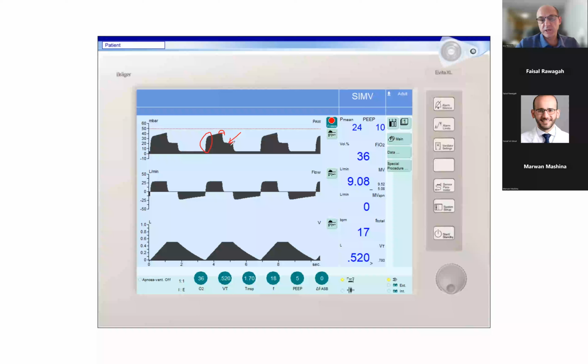we should have. Of course, you're not seeing the progression of the problem, so you're just encountering that the plateau pressure is at the level of 20, and that's kind of a little bit high pressure actually. And now we come back to it and see. But you already mentioned that the difference between the peak and the plateau pressure is high. So that indicates that the problem is airway problem, more than lung or chest wall.